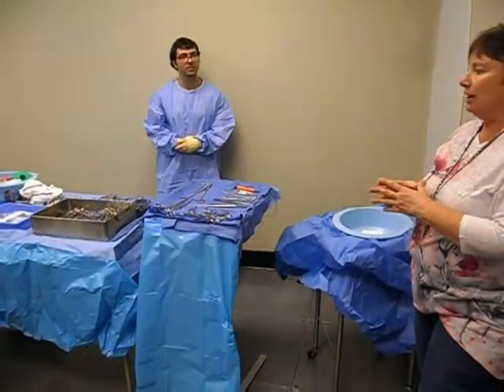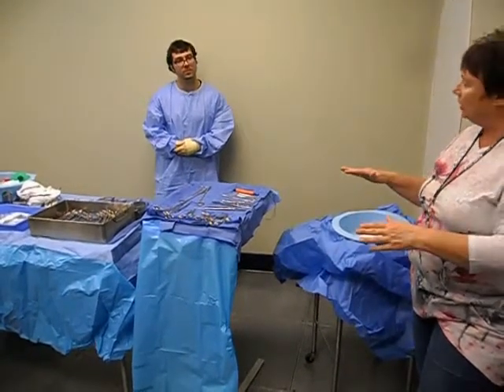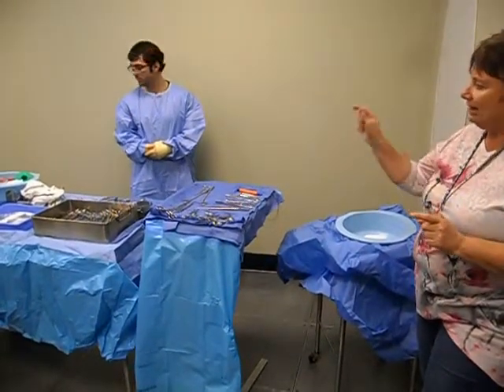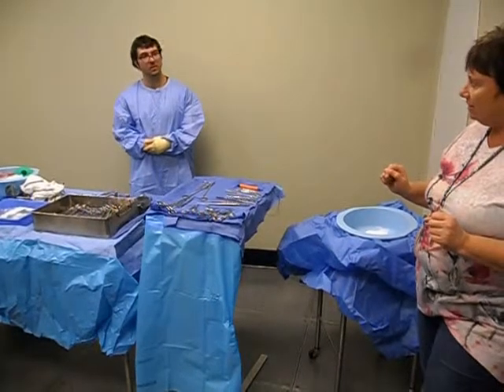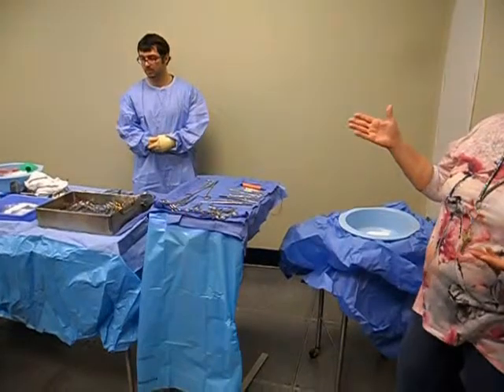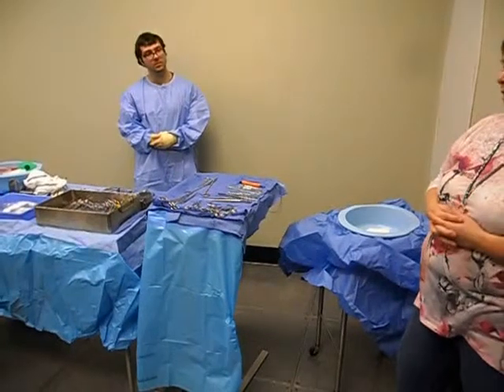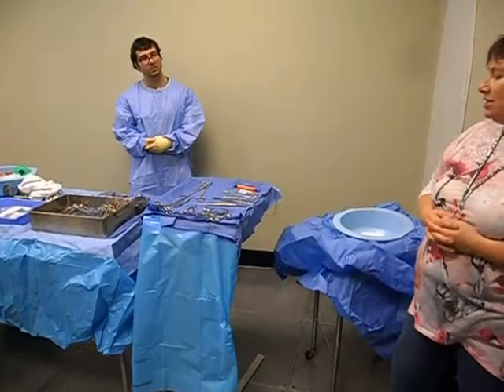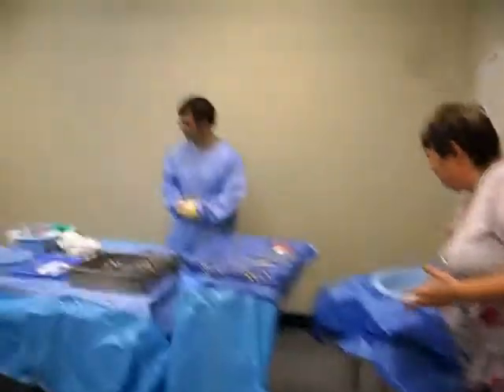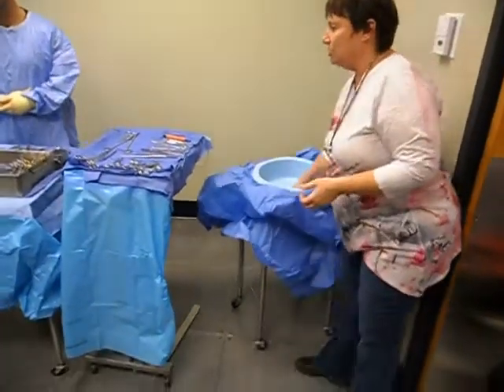I would have not counted my sponges, blades, needles, all of that until I got organized. Because what should happen is your blade should come in a foil pack in probably that ring stand. I mean, that's one way. I could have given them to you as an RN, but because of that, you kind of needed to dig through that first and get organized before you count it, I would say. So let's keep going at this point. You're over on your time, so you're going to need to speed up a little bit with that. This you want to bury. These are not X-ray detectable, so I would have put those under there.